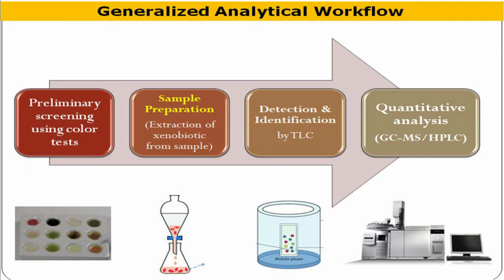After sample preparation, you can do screening, detection and identification of those benzodiazepines, which I'm taking as an example. And after detecting that, yes, a benzodiazepine like lorazepam is present in our sample, you need to quantify, or measure the levels of the lorazepam present in your biological sample. So TLC is not a technique for that. This is the main drawback of TLC. TLC is not a technique which can quantify the levels of the drug in biological samples.